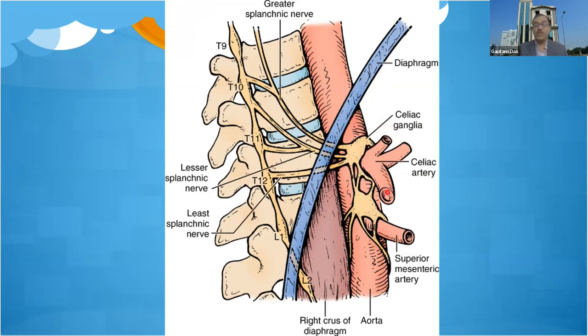So whether you are doing under the ultrasound guidance or under the CT guidance, where is our target? This is the aorta, anterior to the aorta, around the celiac trunk. This is our target. So when we are doing it under the ultrasound, we are looking for the celiac trunk, celiac artery. So the seagull sign, it is giving branches.